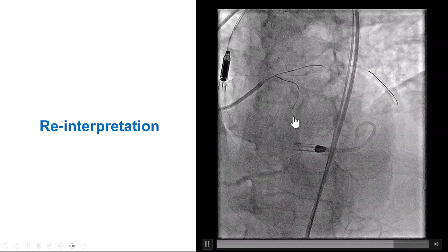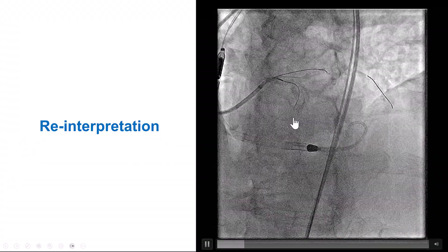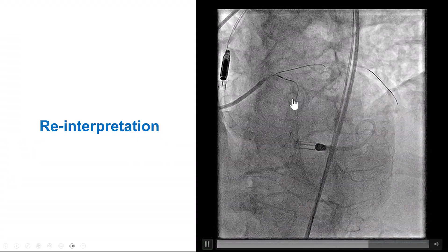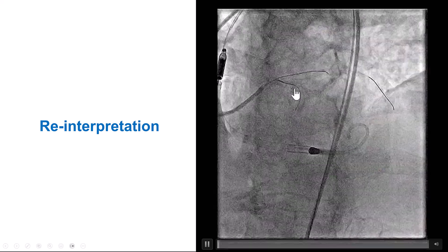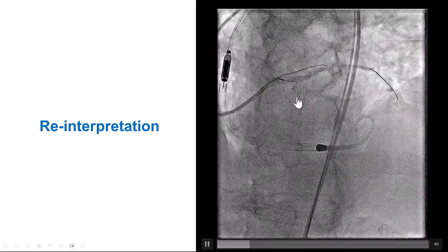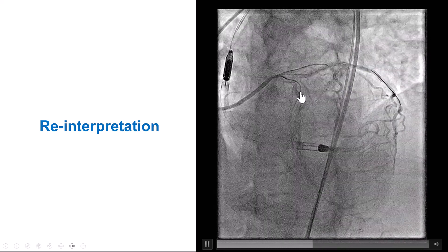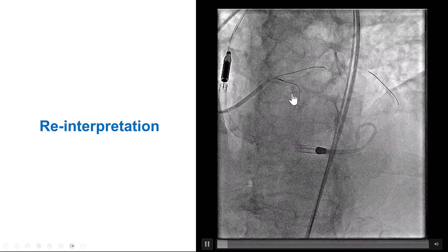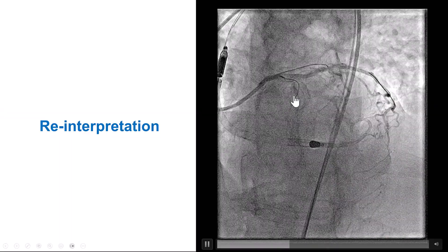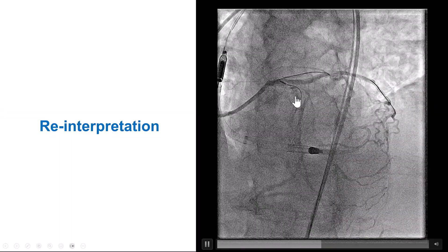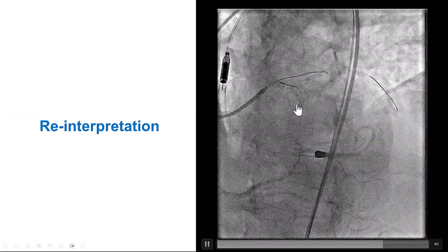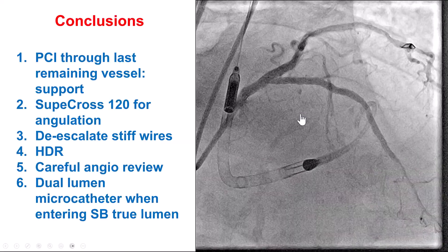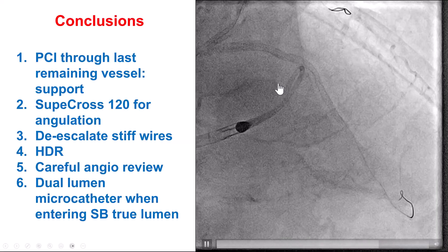Bringing back the original picture from when the wire went into the subintimal space: retrospectively, from what happened, it turns out that what we were seeing there was not the true lumen — it was probably the extravascular space, an extravascular hematoma. The true lumen was higher up along the course of that guide wire. We were literally fooled by the appearance of contrast and confused the true lumen with the false lumen.